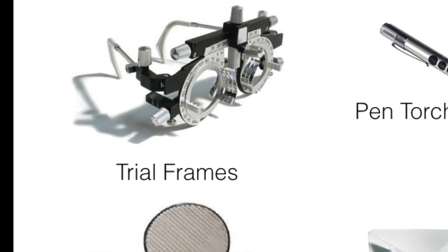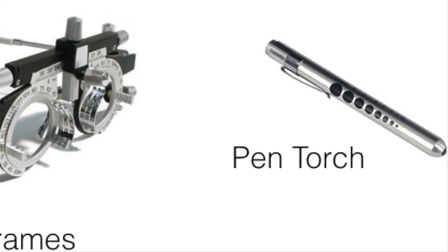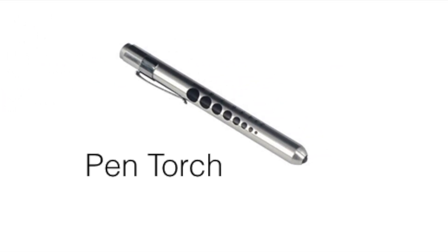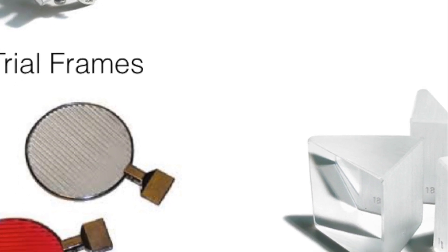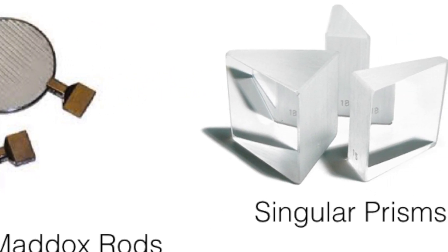For this test we will be using trial frames, a pen torch, two loose Maddox rod lenses, and loose prisms. You may use two red or one white and one red Maddox rod to allow easier identification of which line belongs to which eye.